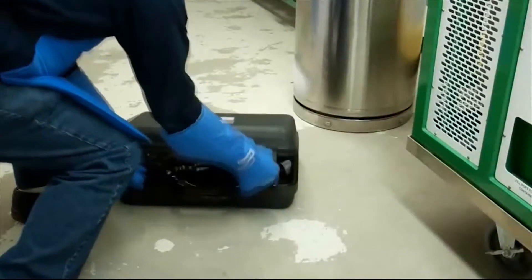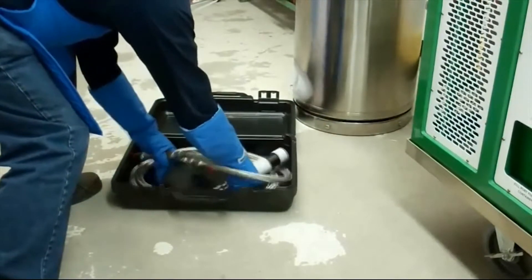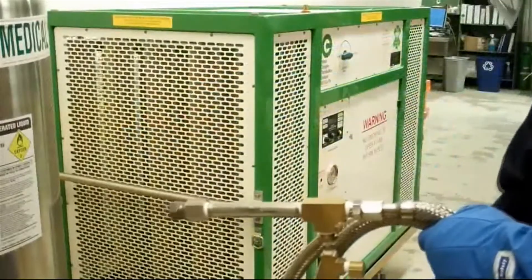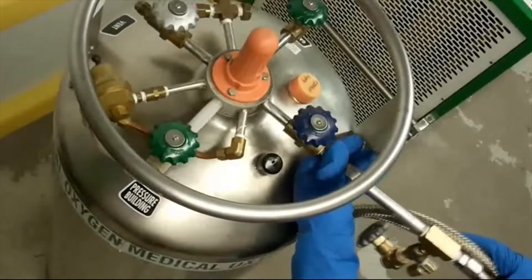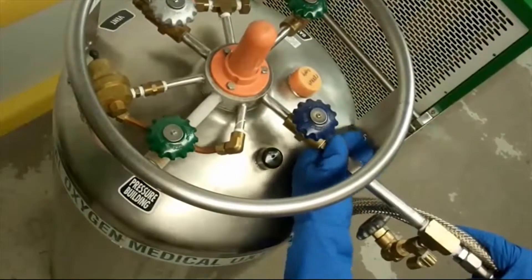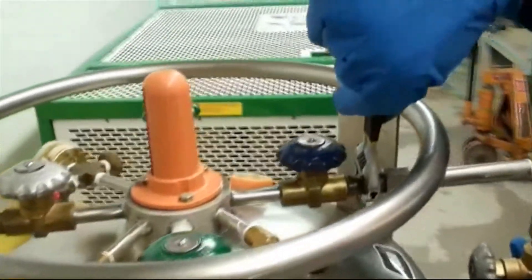Remove the Essex Cryogenic hose, harness, and female filler valve from the case. Remove protective caps from the harness. Attach the fill harness to the liquid side of the VGL. Ensure the vent valve is pointed downward. Wrench tighten your fitting to the VGL.